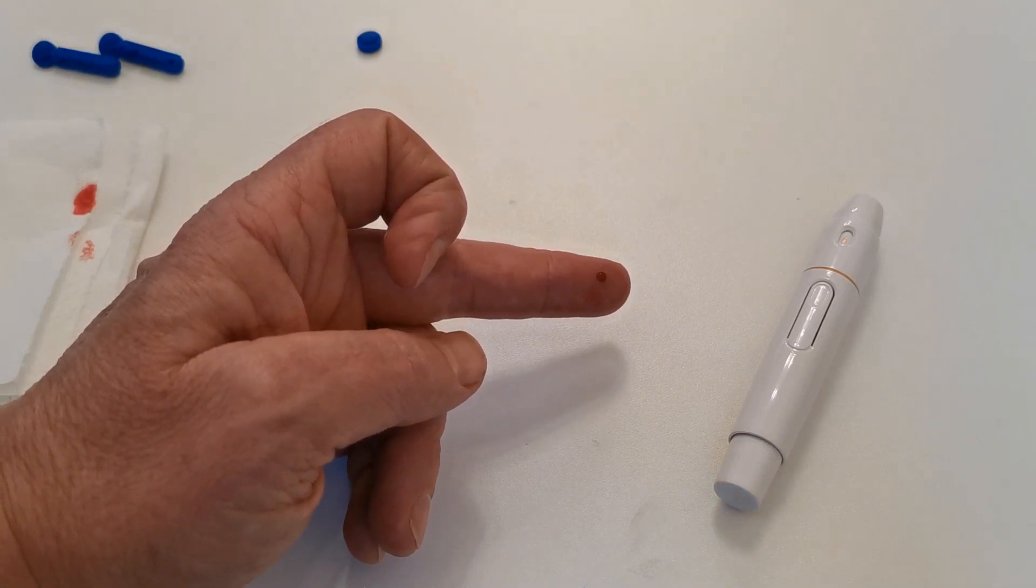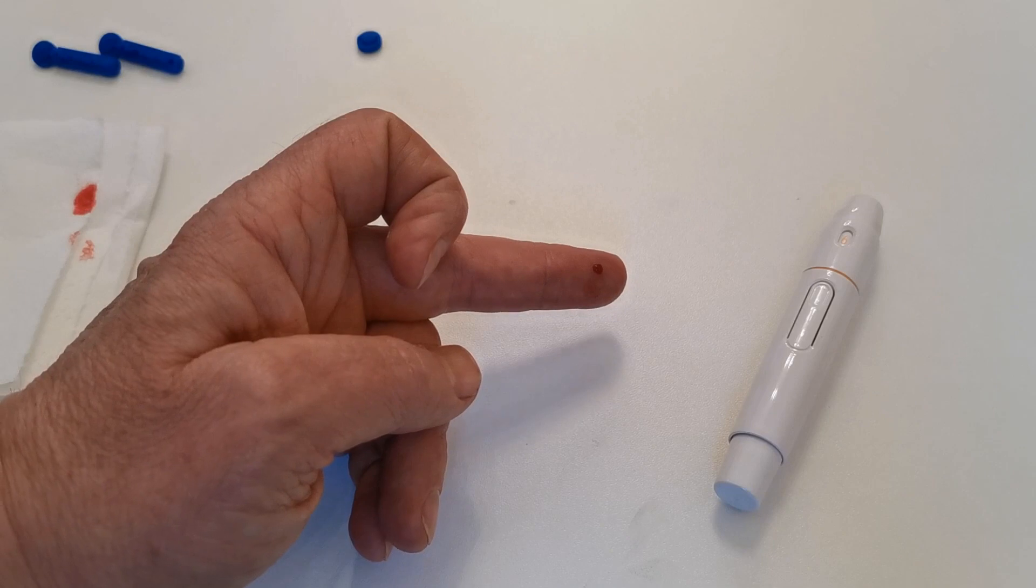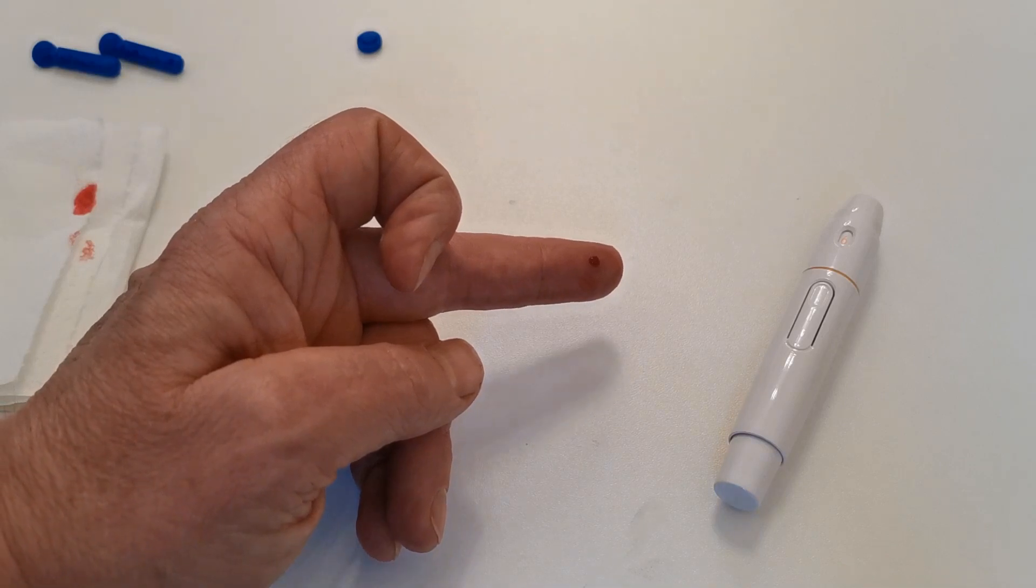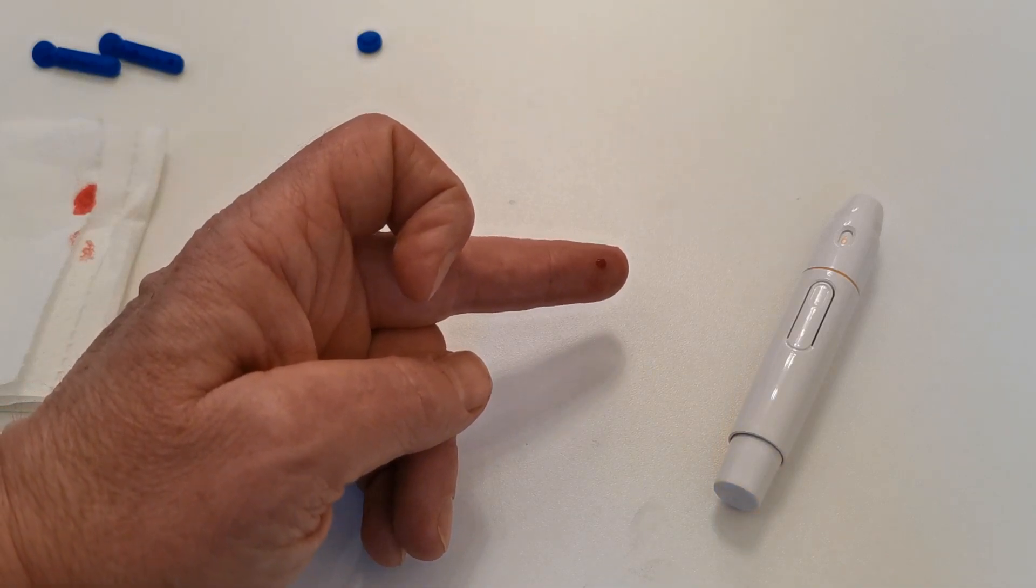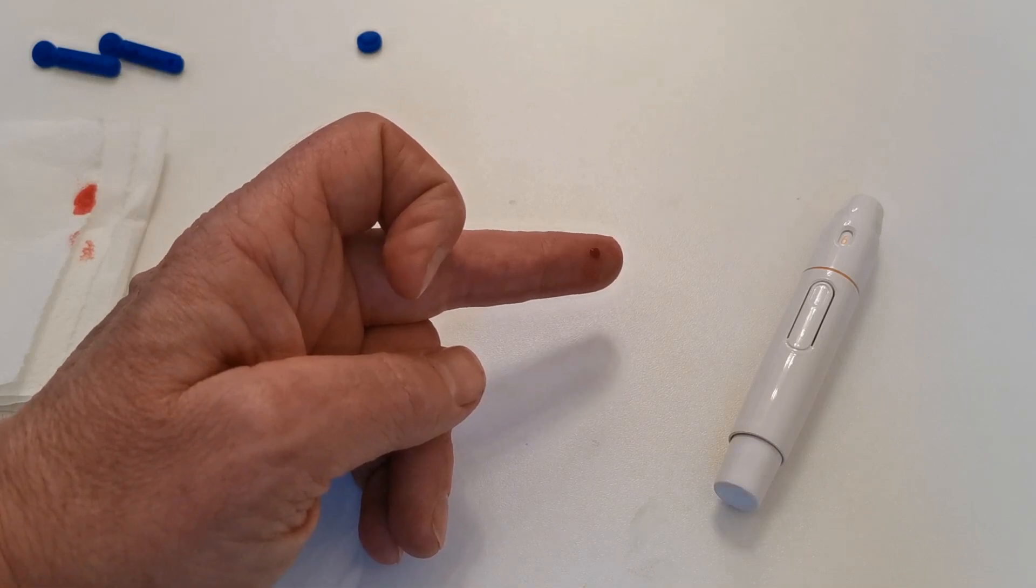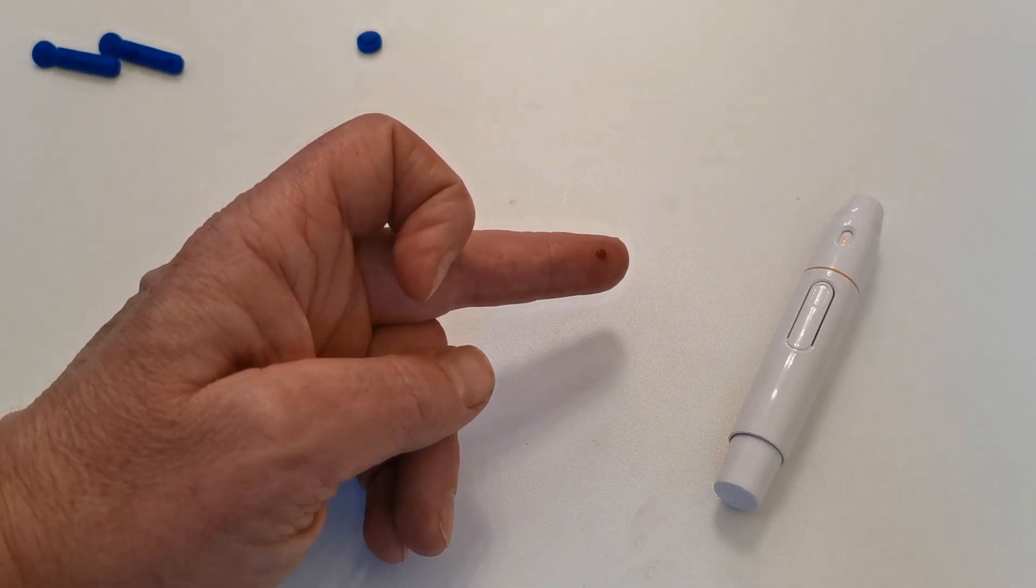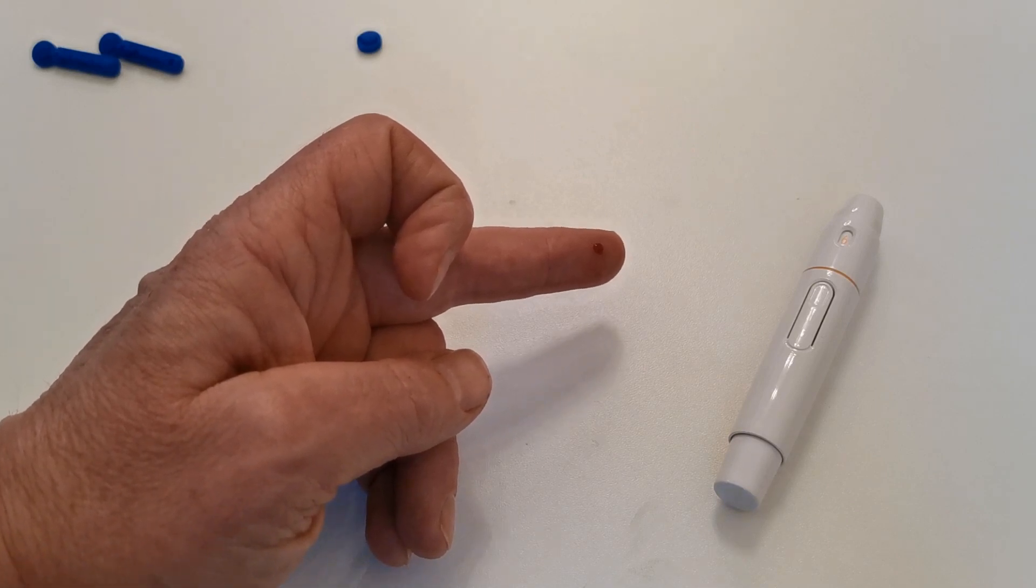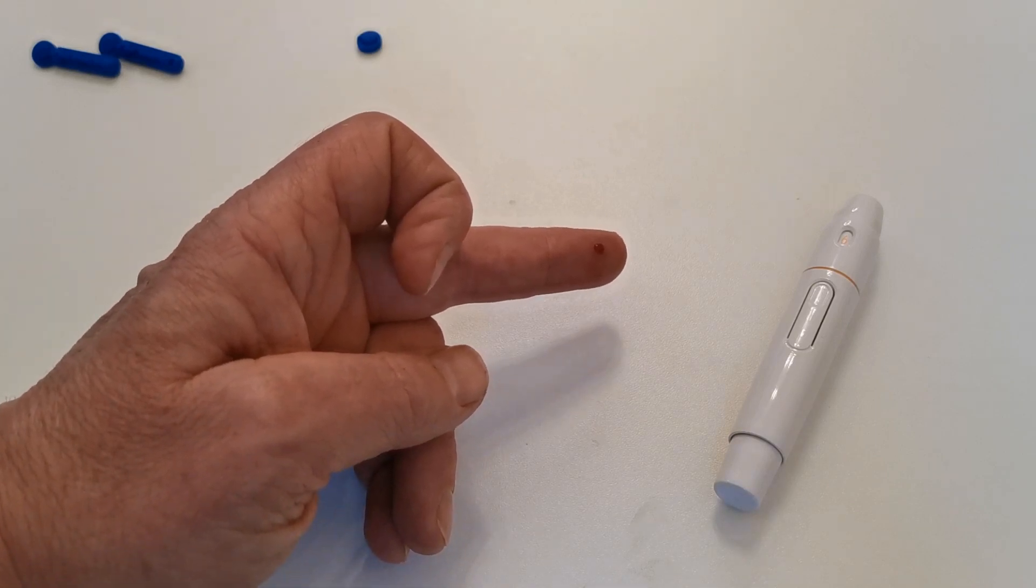If you've not lanced yourself deeply enough, then be prepared to re-lance rather than trying to use an inadequate sample or a sample that you've had to form squeezing your finger to run your test device. By doing this method and using a naturally formed second droplet of blood, you should get good quality test results on both cholesterol, uric acid, hemoglobin and glucose tests.